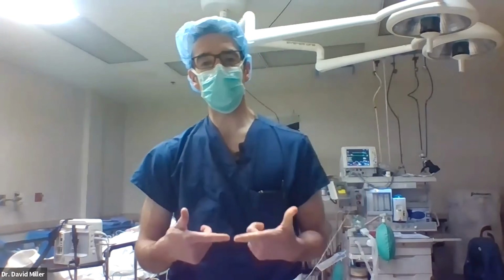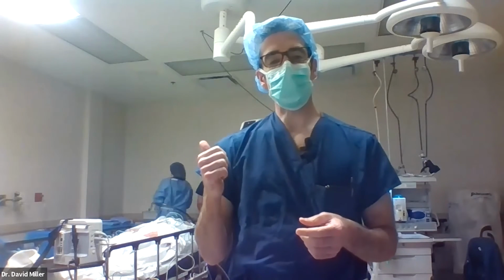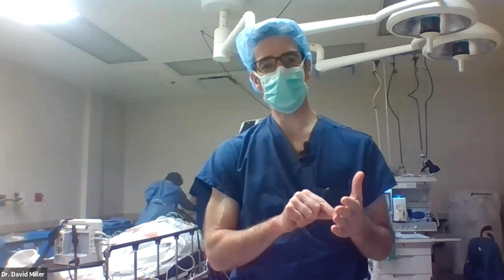Yeah, I think there is utility in looking in the operating room to find the breaks. You kind of want to know what you're coming into. This case was identified, the prior case where it was hard to identify the breaks, it even had a question mark for my partner, looks like break here, right? So he kind of nailed the area. Dr. Hall has a very good eye. He nailed the spot where the retinal tear was at.